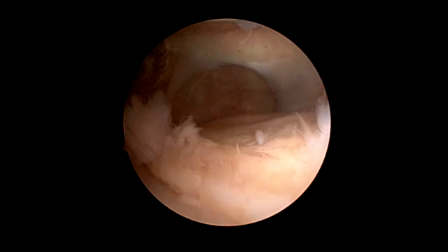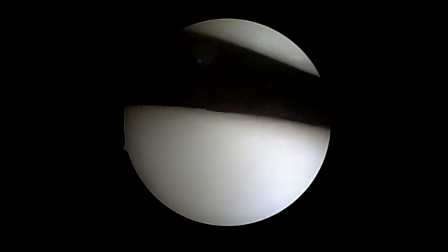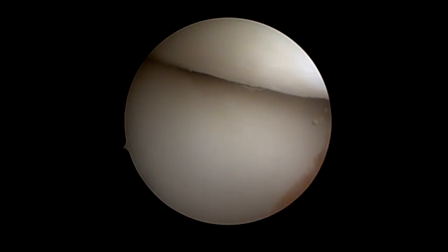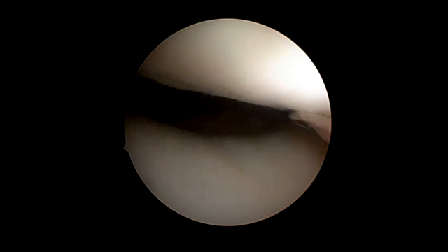Now we are inside the joint. You see the patellofemoral joint — there's only minor synovitis. Then I flex the knee in order to see how the femoral patellar alignment is.